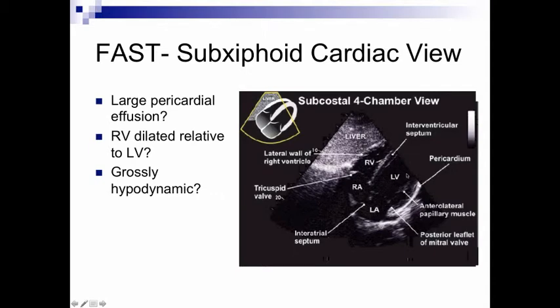And depending on, and this is something that Shruti kind of alluded to, depending on where your indicator is, it'll basically affect which way the apex of the heart is pointed. So if you think about a FAST exam being done with the indicator to the left and the probe positioned with the indicator to the right of the patient or to your left, then the apex of the heart is going to be pointed to you.